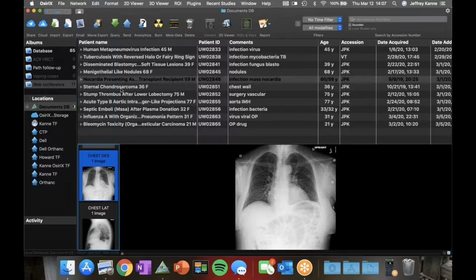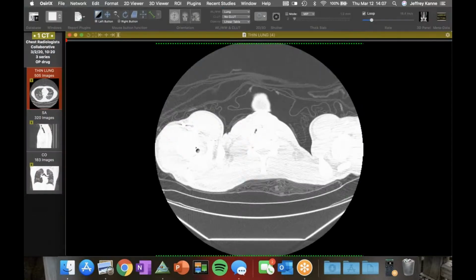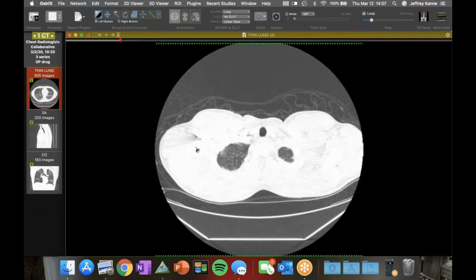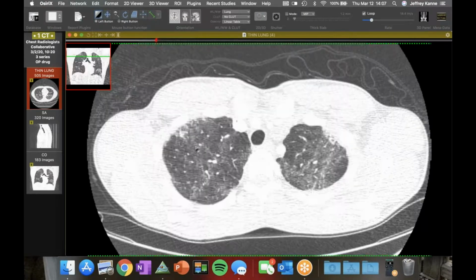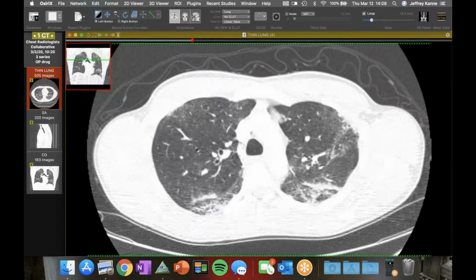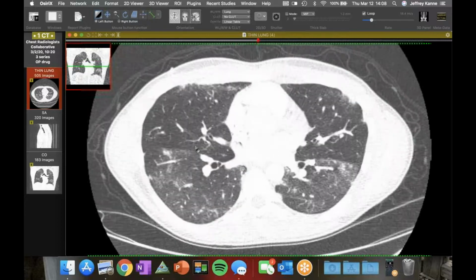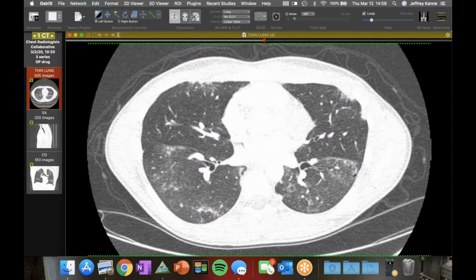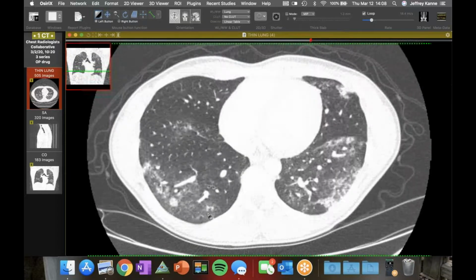Let me see. I'll just show one more. This was a pretty case. So this is a young guy with testicular carcinoma, sort of a mixed teratoma, and came in just for his routine follow-up. And he had just, he'd been on I think 3 or 4 cycles of chemo with this radiograph, and you can see a very nice organizing pneumonia pattern. It does seem to have a little bit of small nodules associated with it, but pretty good perilobular thickening like that.